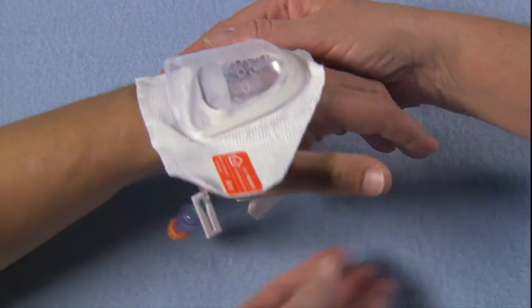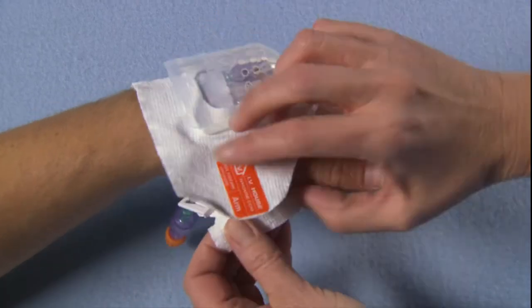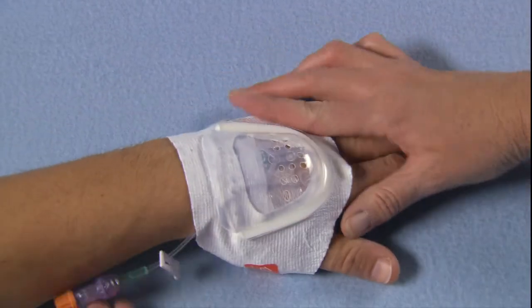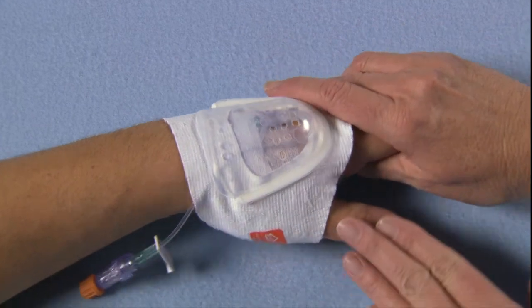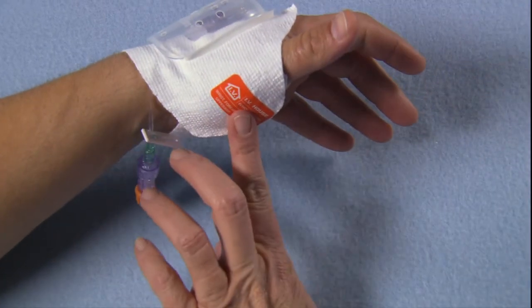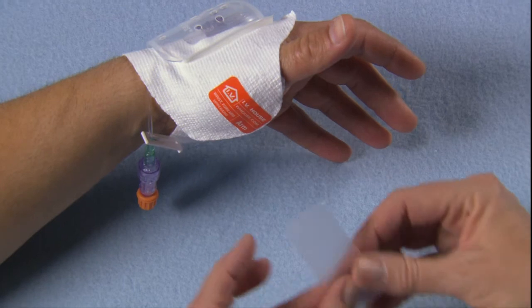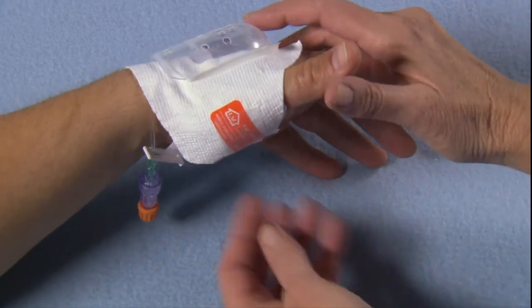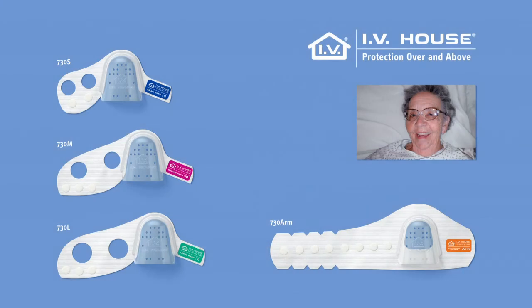Change the IV House Ultra-Dressing each time a new IV is inserted. Removal of the device does not harm skin or pull hair. All IV House devices comply with CDC guidelines and the 2011 Infusion Nursing Standards of Practice.